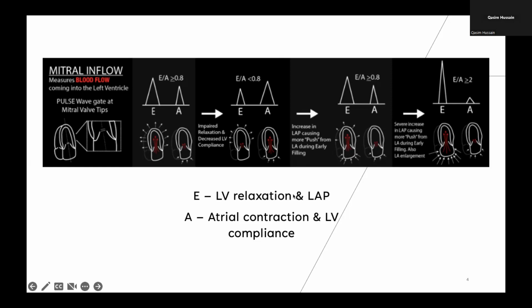So you'll actually recreate this left atrial pressure gradient. It will be so large, it'll actually make your E wave look normal again. And this is called pseudo normalization, because your myocardium's ability to relax is still impaired, but just because of the chronic compensation, your left atrial pressure has gone so high, it's now just pushing all that blood through, and you're still attaining the same velocities you would in a normal heart.